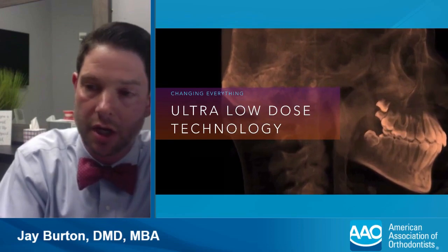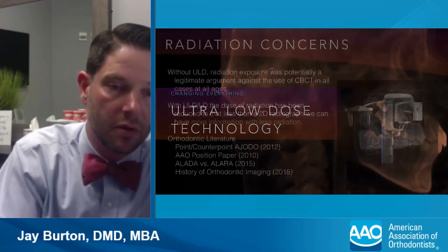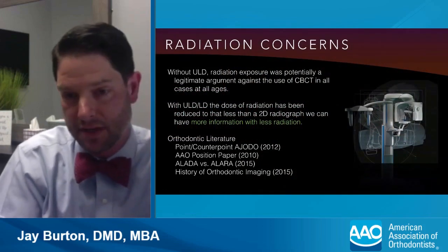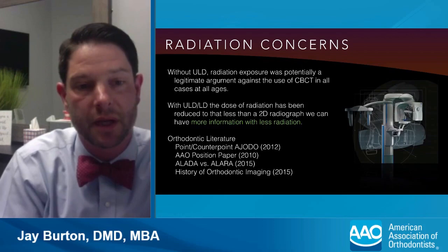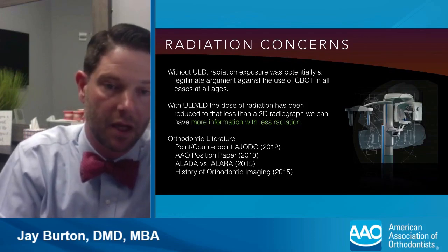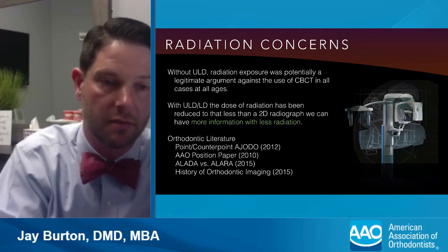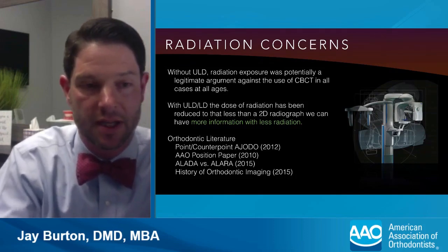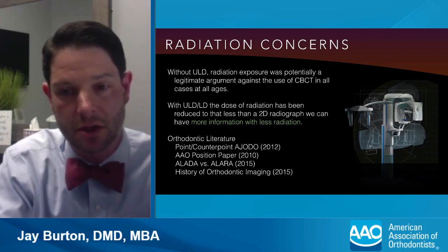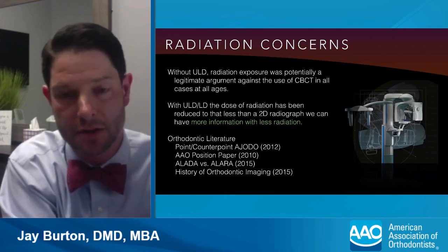So what really changed everything for me and pushed me to adopt this technology was ultra-low dose CBCT imaging. Without ultra-low dose, radiation exposure was, I would have said, potentially a legitimate argument against the use of CBCT in all cases. Even though you got, with the newer machines, more information and with less radiation, some of the older machines certainly were radiating patients at higher doses than 2D.